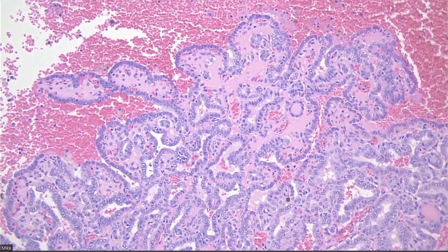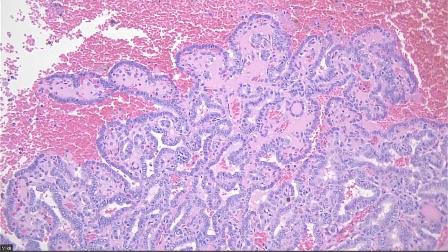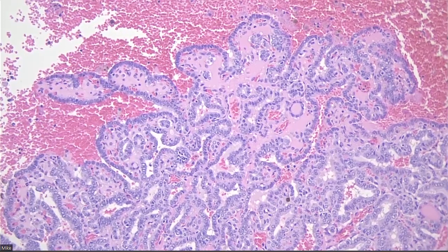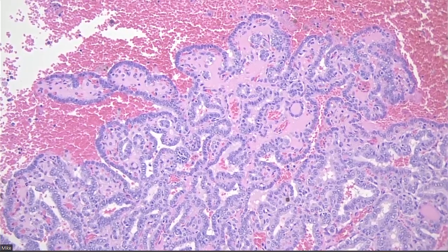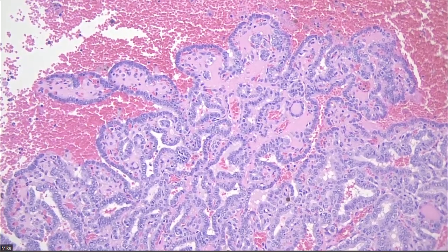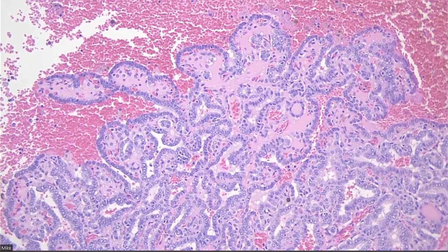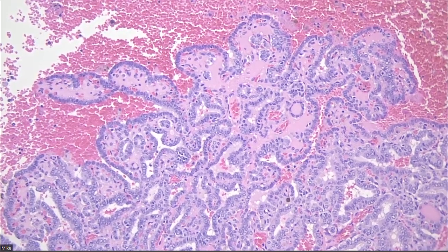Rather than on H&E, just throw them for molecular, spit out the molecular, and then I'll look at the H&E. That's why having the molecular on FNA for me has been a game changer, because if I have that knowledge, it really informs my diagnosis. And I really believe that we should be practicing thyroid like we do with brain tumors and bone tumors and sarcomas, because it matters.